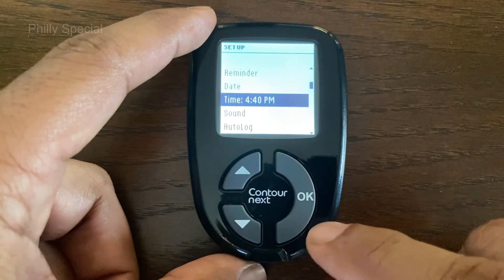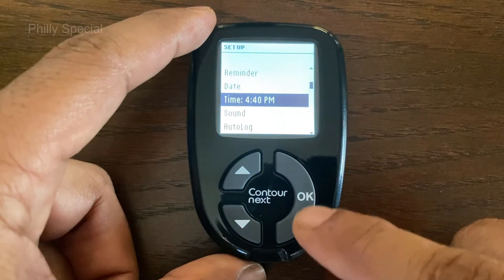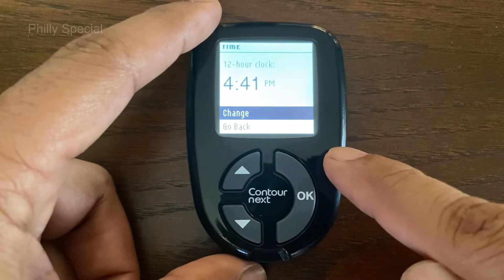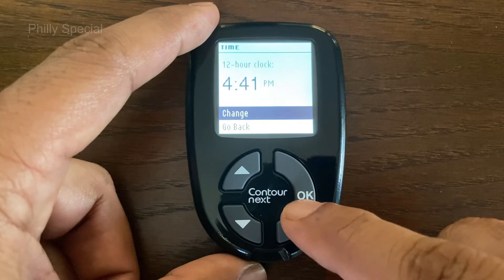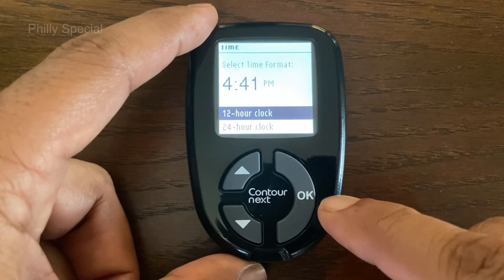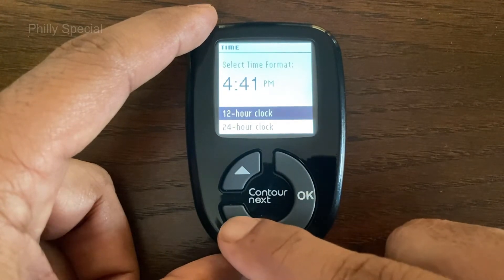To make changes to the time, on the setup menu page highlight the time option and press OK. Change will be highlighted. Press the OK button.